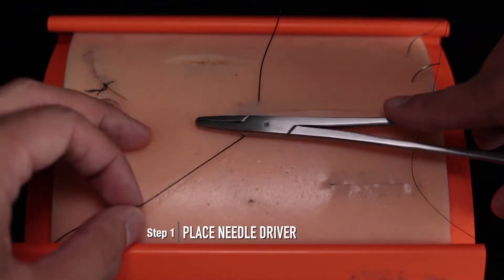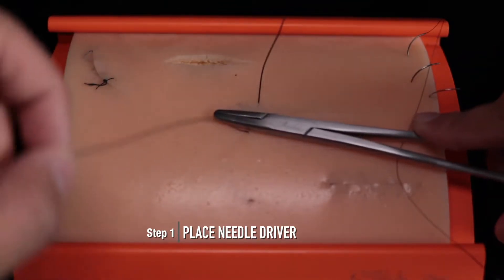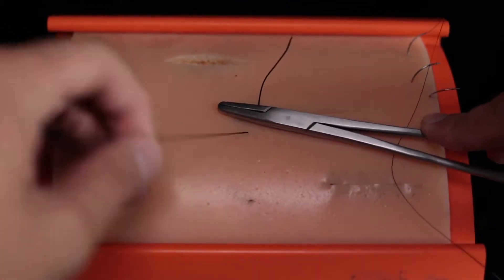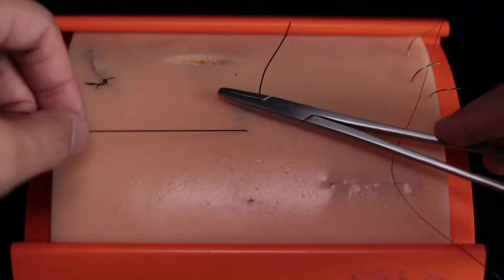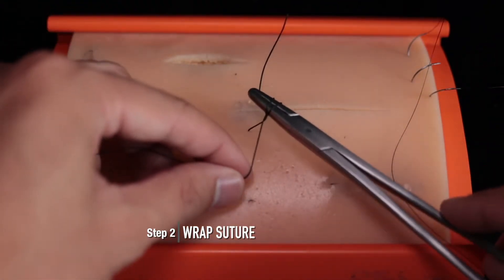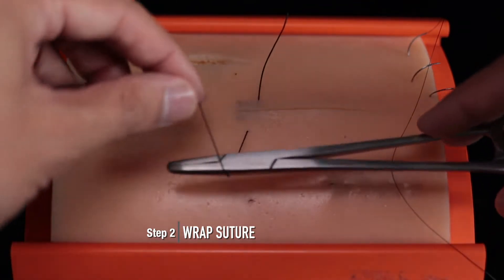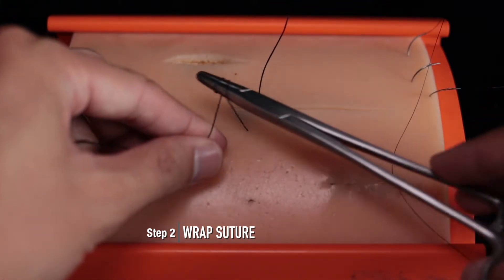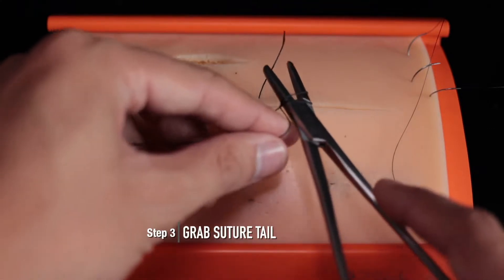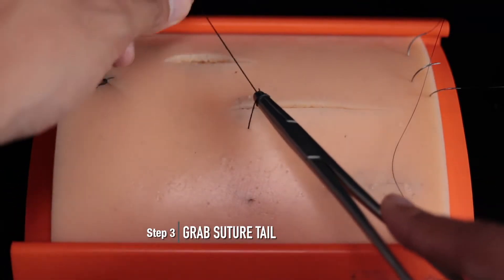The first step will be to place your needle driver in between both ends of the suture. The second step will be to wrap the suture with your hand around the needle driver twice. Some people will use the needle driver a bit more and some people will use their hands a bit more — it doesn't matter as long as you get it done. Then grab the suture tail with your needle driver, pull through, and tighten.